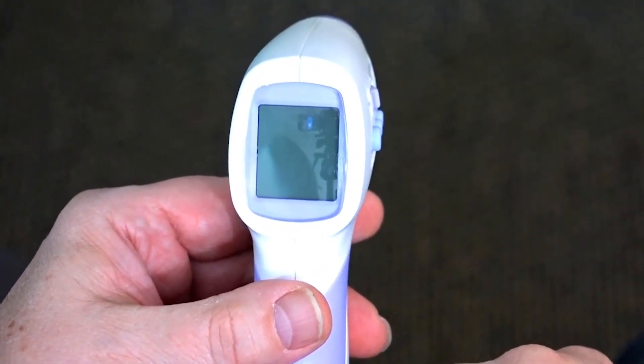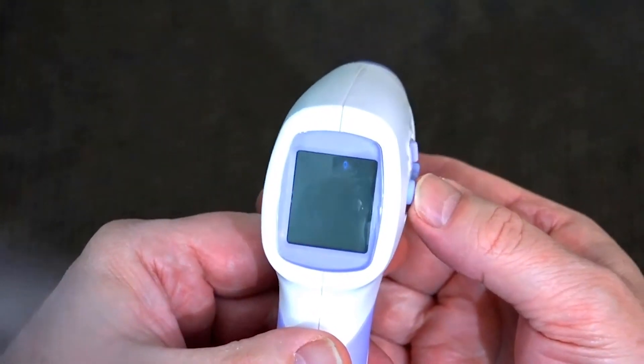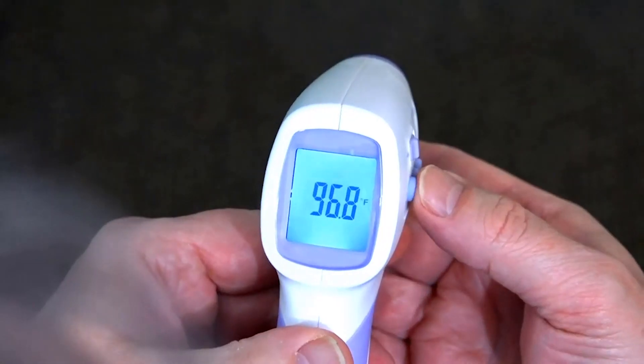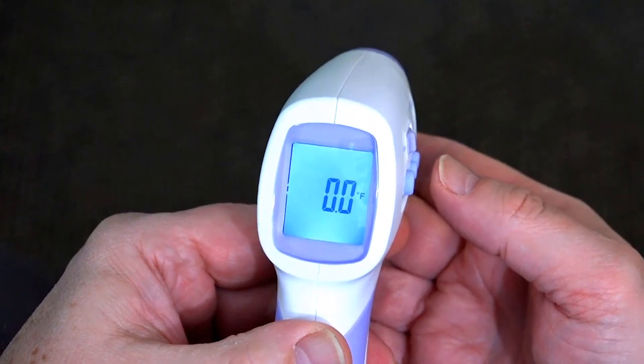To enter the calibrated setting difference, hold the mode button down for 2 seconds. The F1 is displayed. Press the mode button with consecutive button presses until F3 is displayed. Use the up or down arrows to enter the calibrated temperature difference.